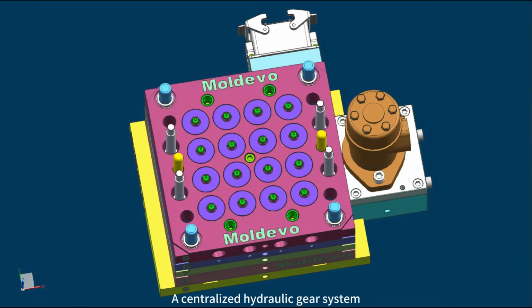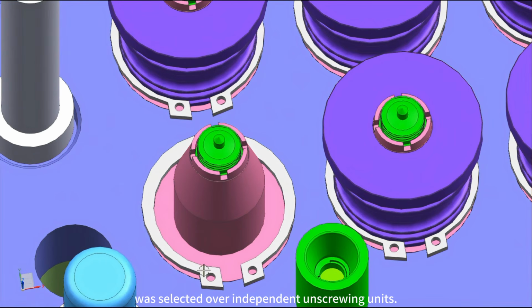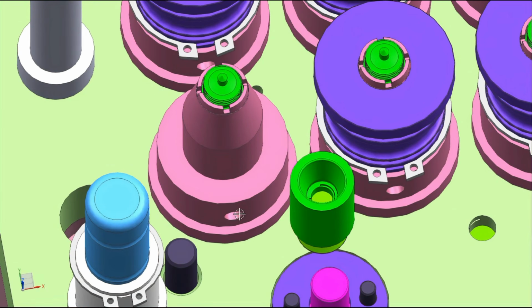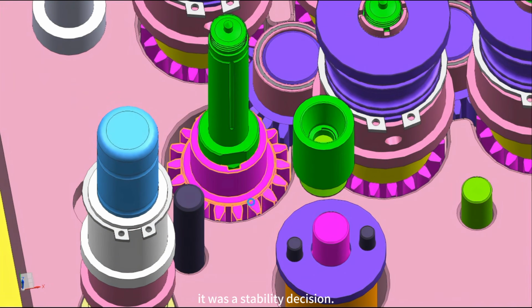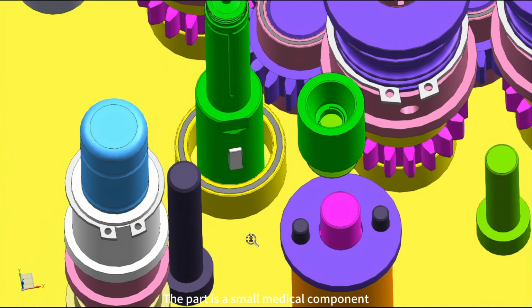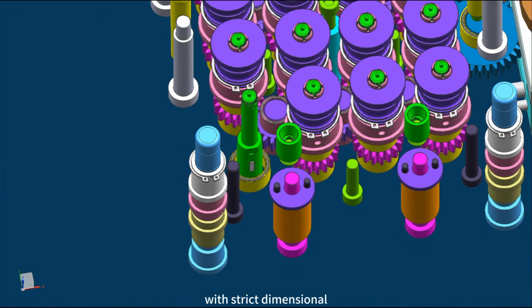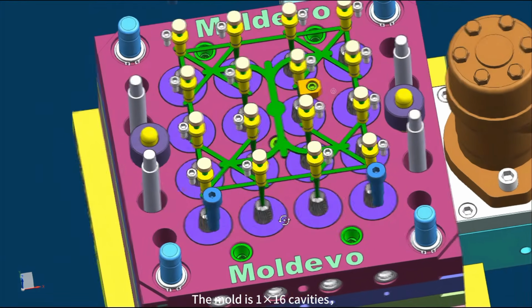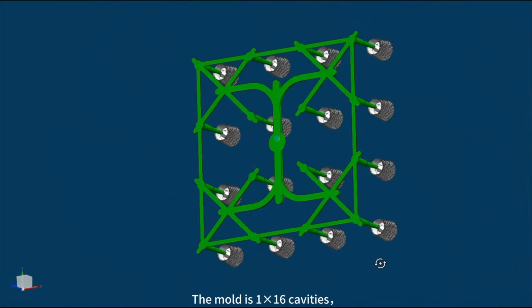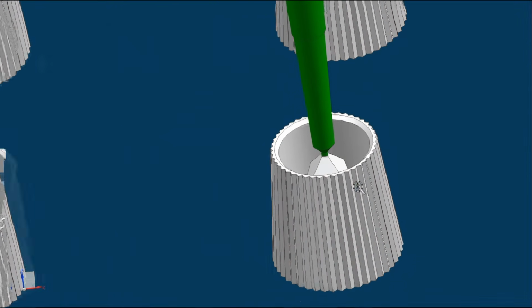A centralized hydraulic gear system was selected over independent unscrewing units. This was not a simplification. It was a stability decision. The part is a small medical component with strict dimensional and surface requirements. The mold is 1×16 cavities, 3-plate cold runner with pinpoint gate.